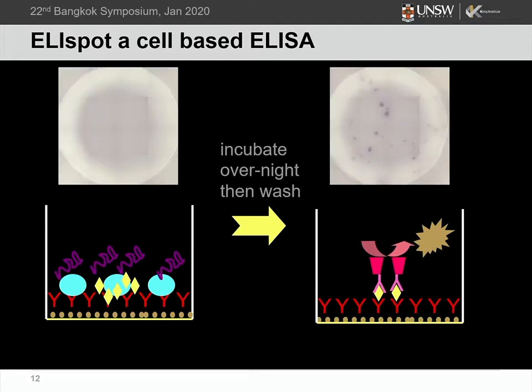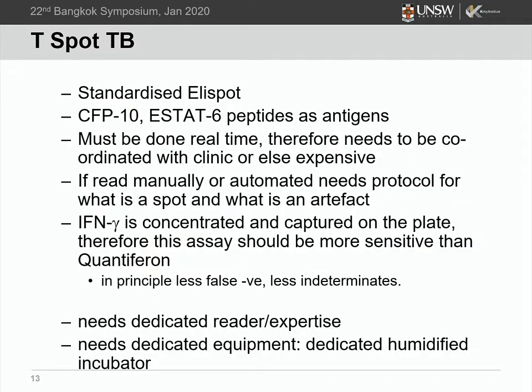And they haven't shown up very well, but this is supposed to show you what the background looks like, and this is what the spots look like in the bottom of a plate. And you've got to be able to tell which one of those is a real spot and which one of those is artifact. So there is some skill to that. And you can see that if those spots become blurry by shaking an incubator, these things become difficult to read.